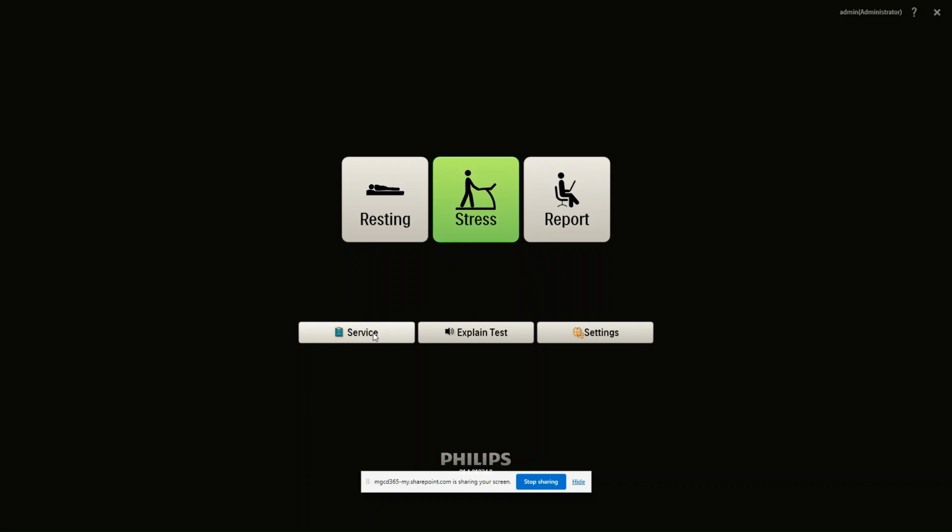Service has its own media module. This is where tokens are applied or device communication is tested. So that is an important area to be accessed.